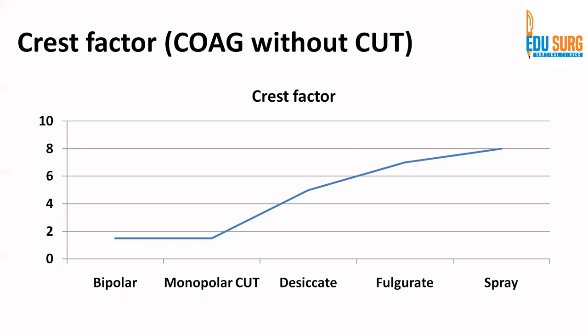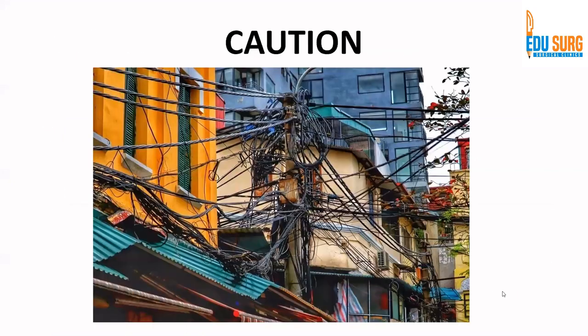And that is why this spray cautery is liberally used routinely by many surgeons after laparoscopic cholecystectomy or in the retroperitoneum to cause coagulation, because we know that it will not cut the tissue unless used totally irrationally, right? So that is why this spray mode is often used for diffuse hemostasis.